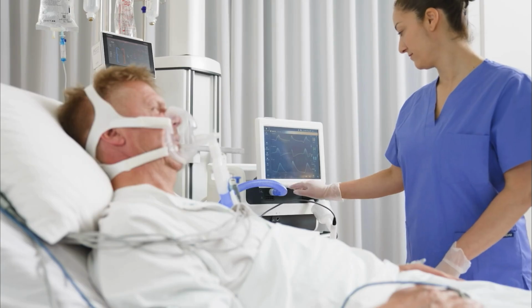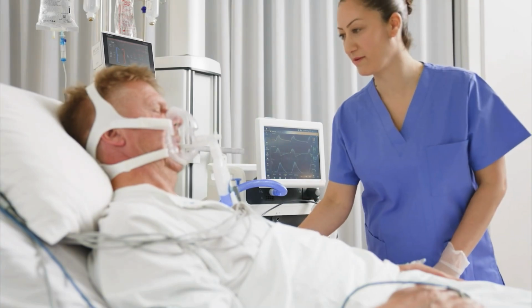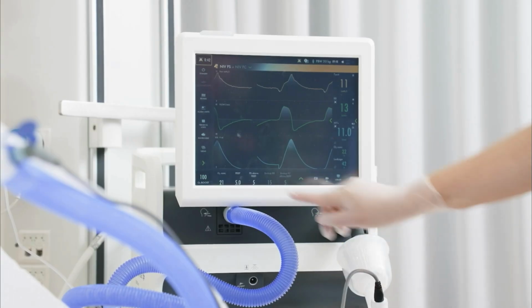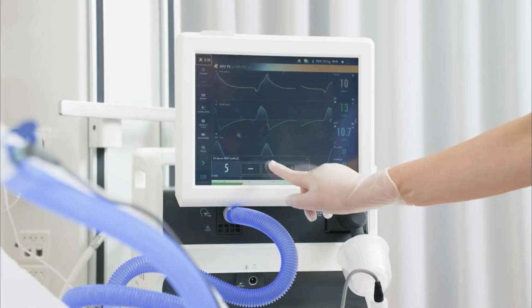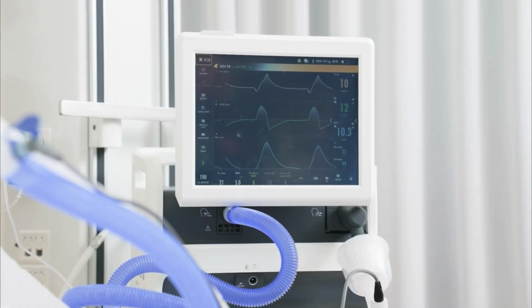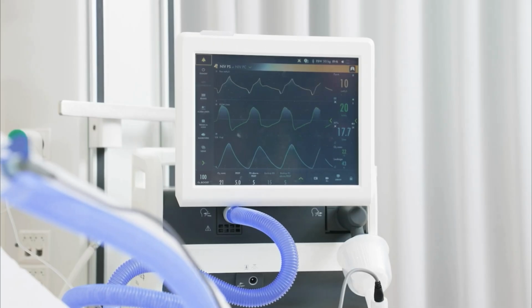The patient controls the respiratory rate, and the ventilator delivers support using the preset pressure support above PEEP or the delta pressure. Start with low PEEP and low pressure support levels above PEEP, giving the patient time to adapt, and adjust accordingly. The trigger sensitivity is automatically adjusted and compensated for the leak.